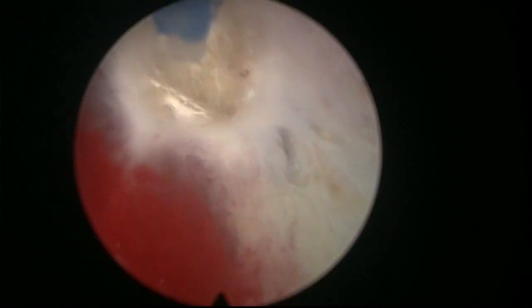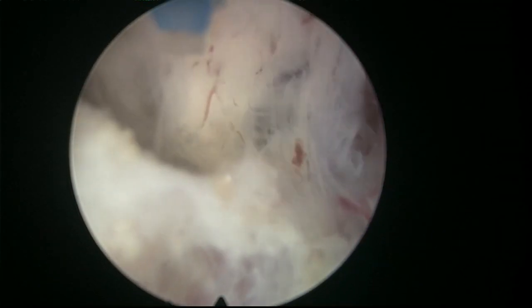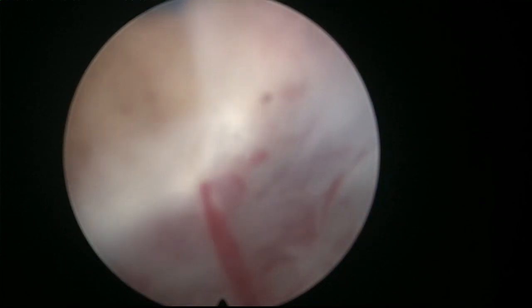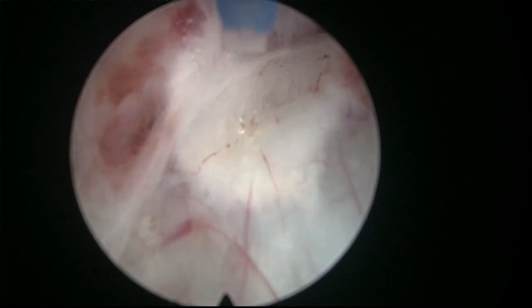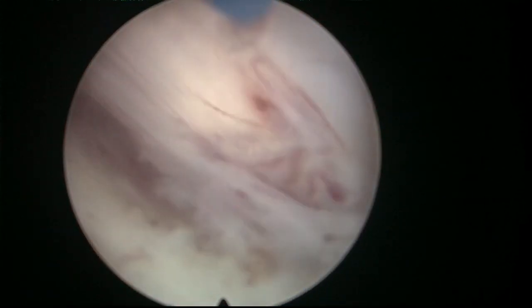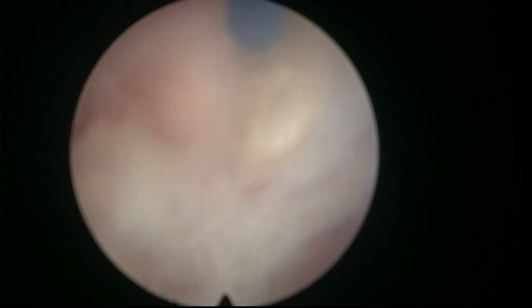This allows the tip of the adenoma to fall down, you know, it comes down, my scope can go. And here we are lowering the tip, you see. So these fibers that sometimes are a little bit parallel to the laser fiber become verticalized, because I'm pushing the nose or the tip of the adenoma down, all these fibers become more accessible now. We can cut them. Just because I position my scope on the lateral aspect, trying to push down the adenoma. And let's see if we can cross over towards the other side. Let's come out and check if, yeah, it looks like a great plane, and now we have connected. We finally release the apex completely, and we are in a good plane. We can continue our dissection now circumferentially.